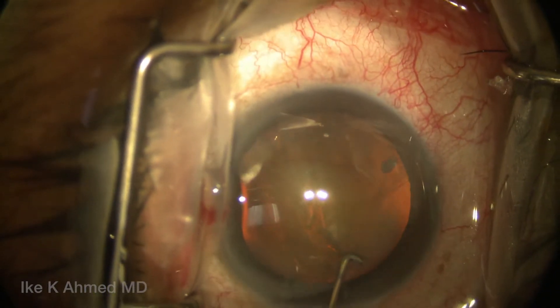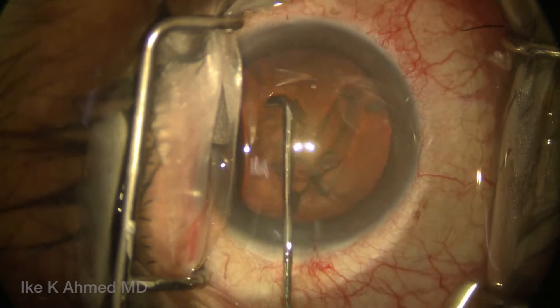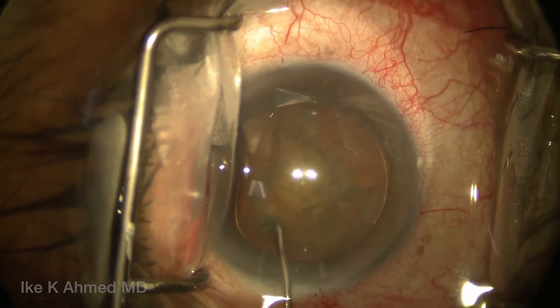This video demonstrates the phaco-hemi-flip technique. Hydro-dissection and hydro-lineation are performed, which is very effective for soft to moderate lenses.